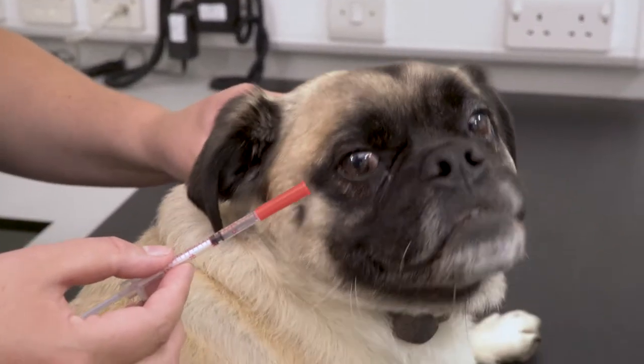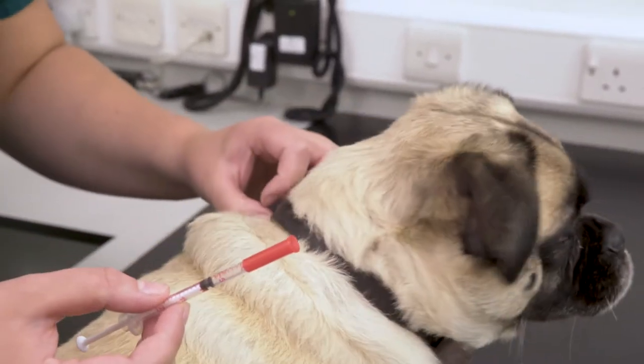With injecting your pet it's really important that you follow the instructions from your vet for storage, how often, and the amount. Special notes need to be made around feeding and when not to give the injection. Prepare the injection following the instructions from your vet.